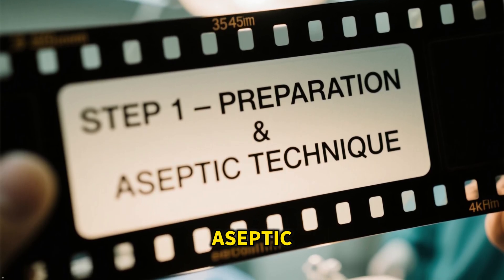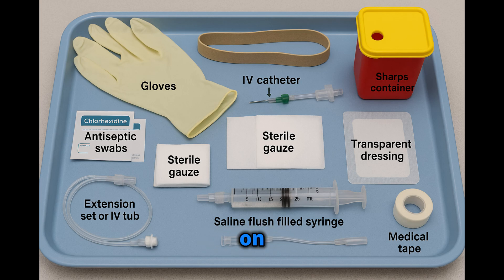Step 1: Preparation and Aseptic Technique. Layout all supplies on a sterile tray. You'll need a catheter — 22 to 20 gauge, common for adults — gloves, tourniquet, antiseptic swabs, chlorhexidine or alcohol, and sterile gauze.